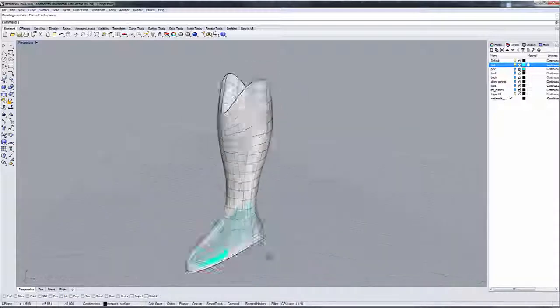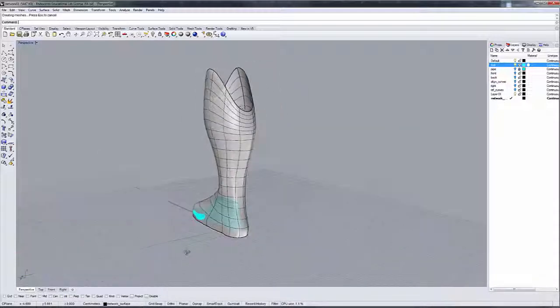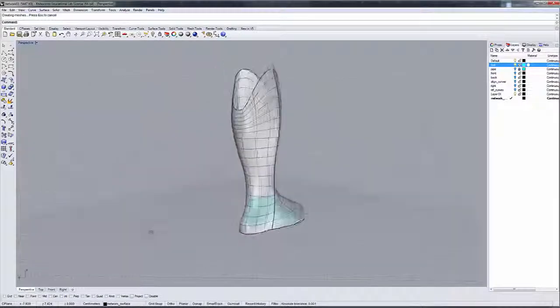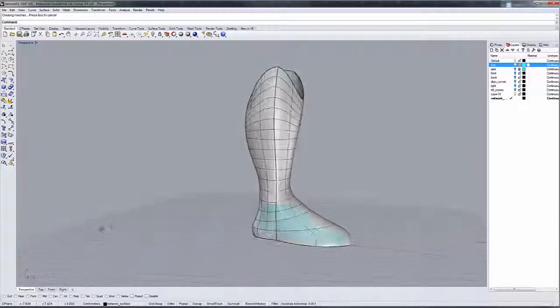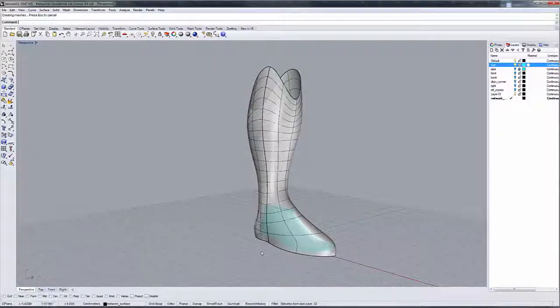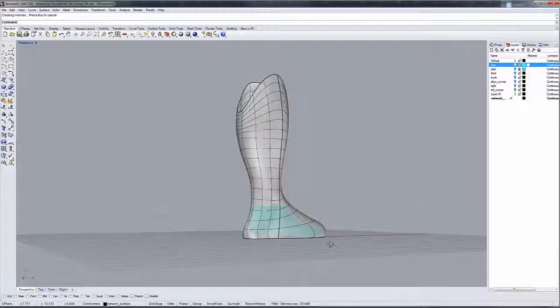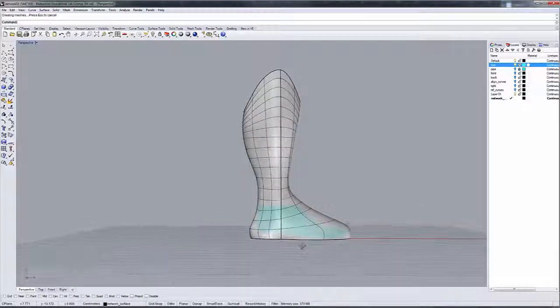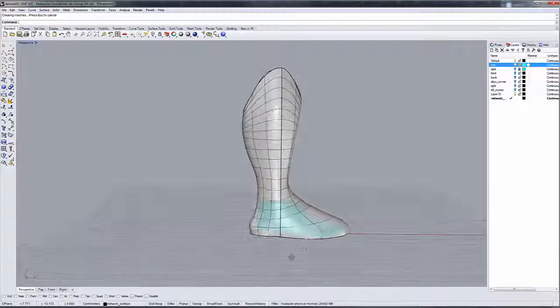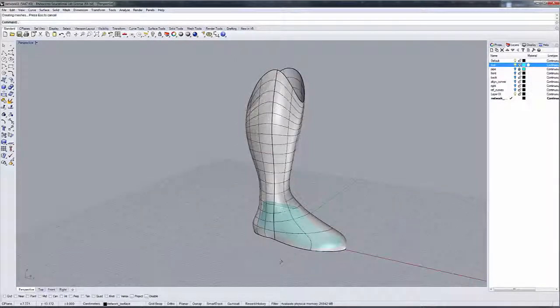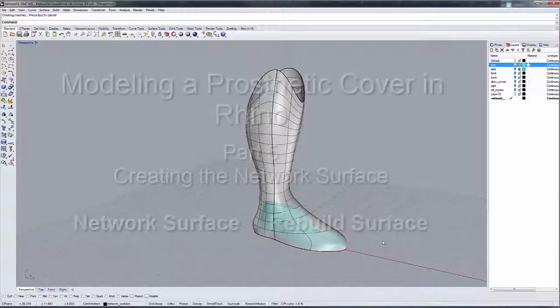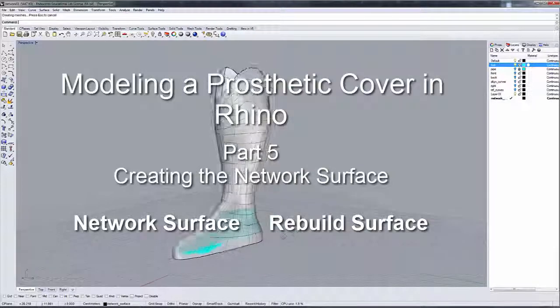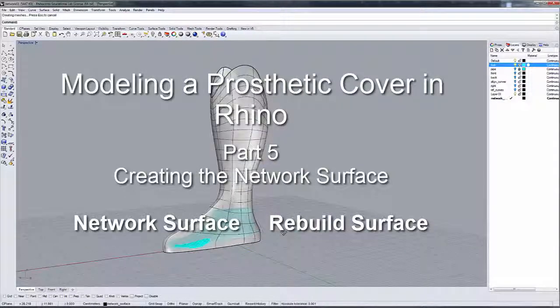And we're going to do some minor adjustments on its shape in the next tutorial. We're going to add the bottom, and then we should be on our way and ready to go into the detailing phase of our model.